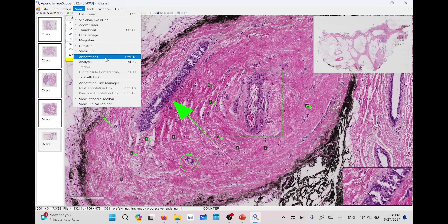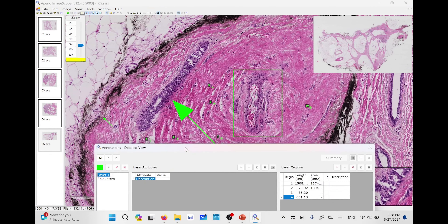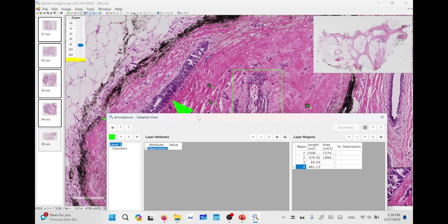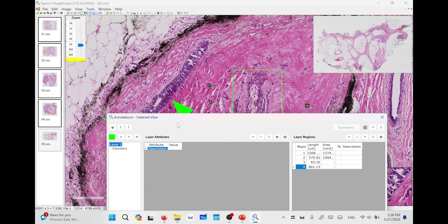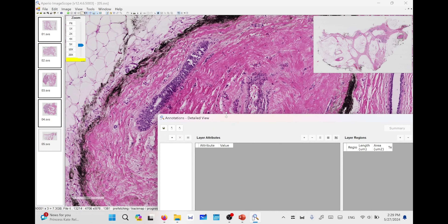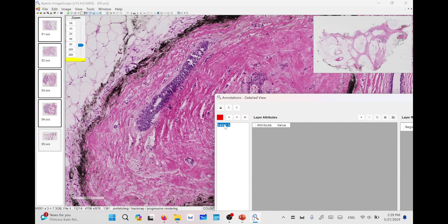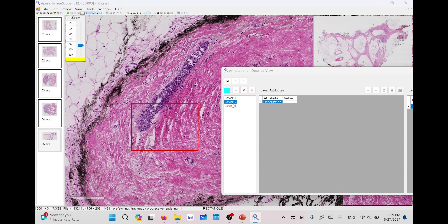These annotations can be accessed using the annotation function from the View menu or by pressing Ctrl+N. You will find the different annotations there, and counters are cascaded to the first layer. Each layer can contain different counters. You can delete all annotations by pressing the double crosses and confirming. You can add multiple layers, and by pressing a layer and starting to annotate, that annotation will be related to the highlighted layer — for example, using the second layer will annotate to the second layer.